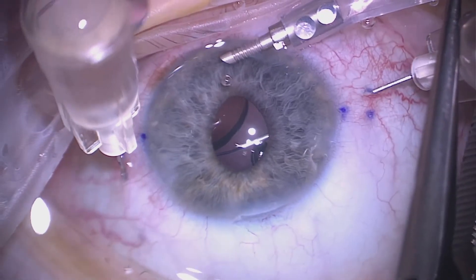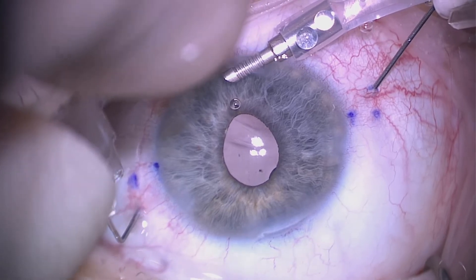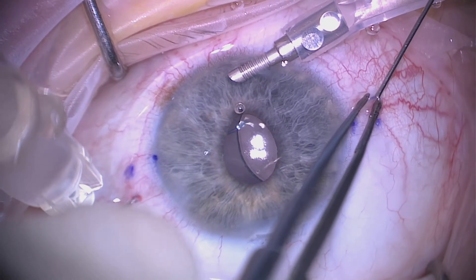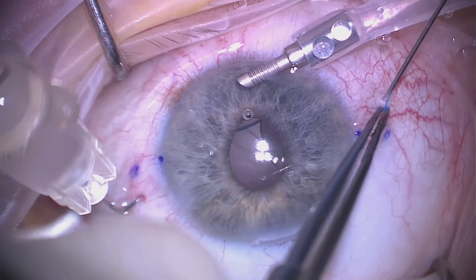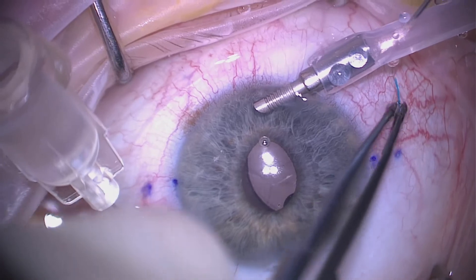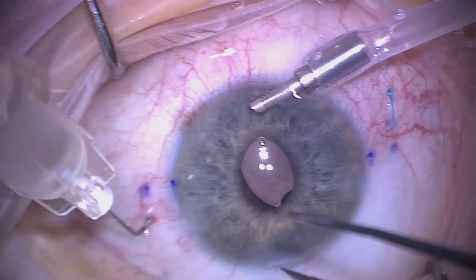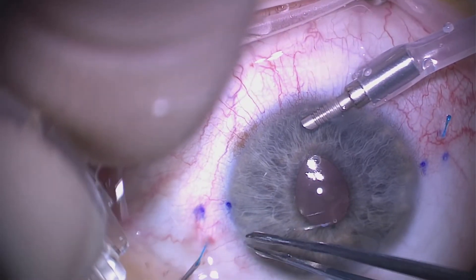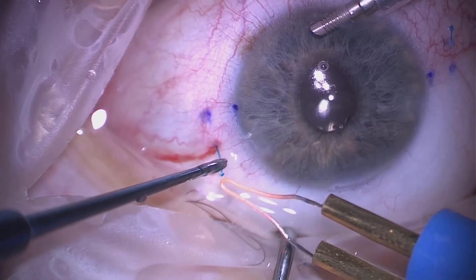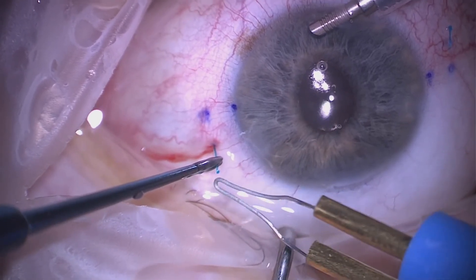We then remove the syringe again and very gently exteriorize the haptics. As we're pulling, the lens is being stretched slightly — it is very important not to over-stretch as this can cause bending and kinking of the haptics, which can affect centration later on. We cauterize about a millimeter of the end of the haptic to form the terminal bulb, which is then pushed and fed into the scleral tunnel we have fashioned.